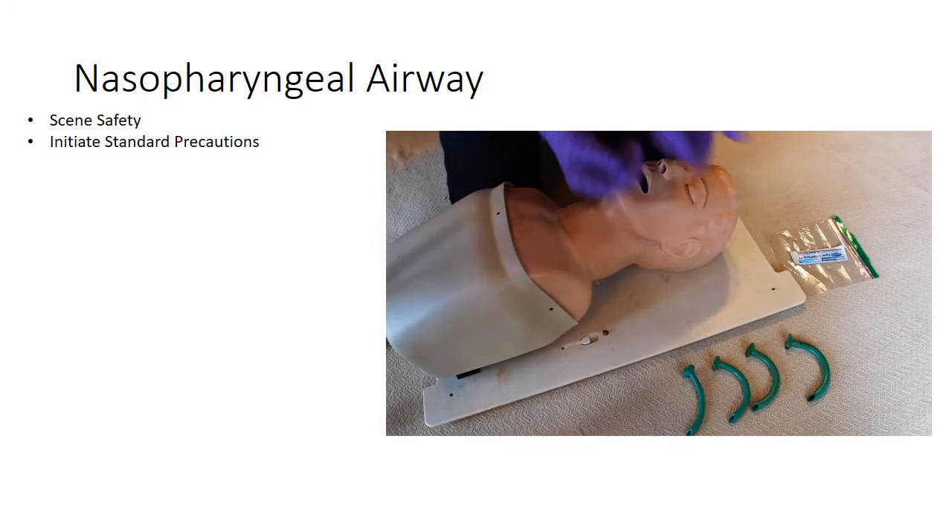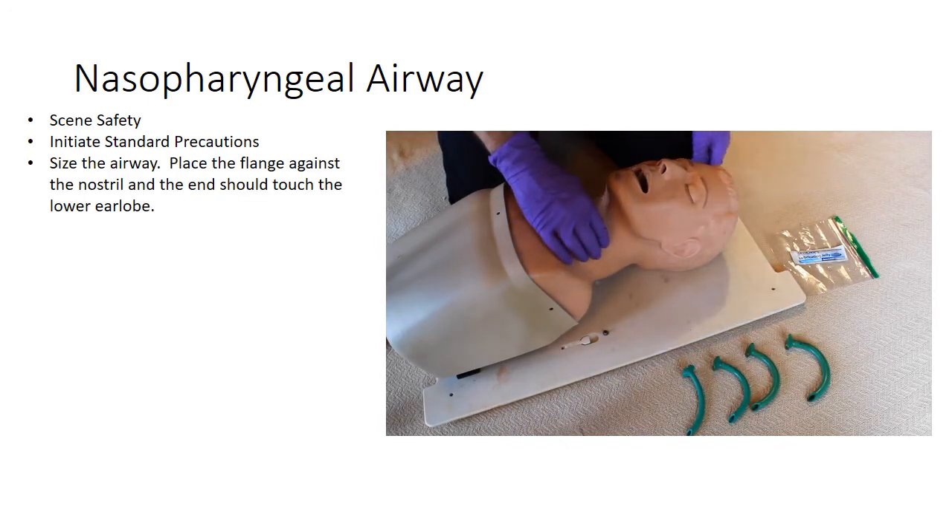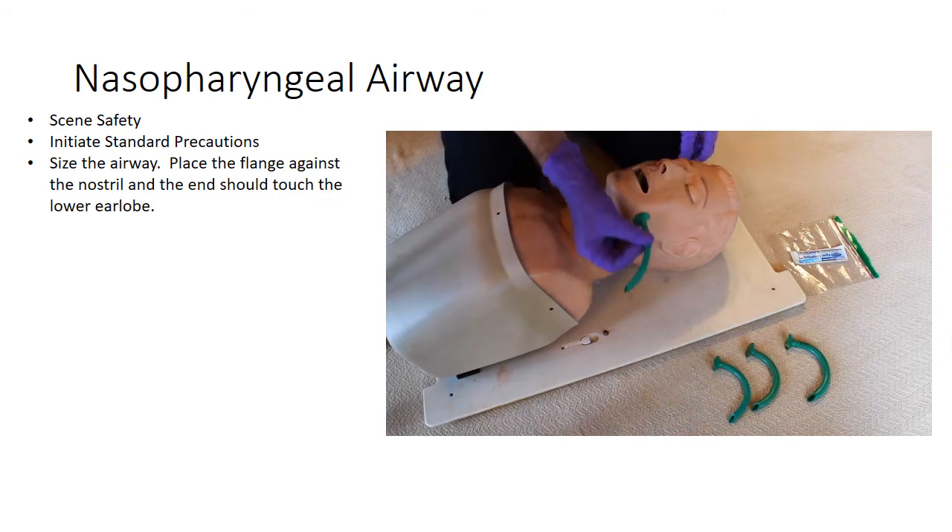Initiate standard precautions and size the nasopharyngeal airway. Place the flange against the nostril — the end should touch the patient's lower earlobe.